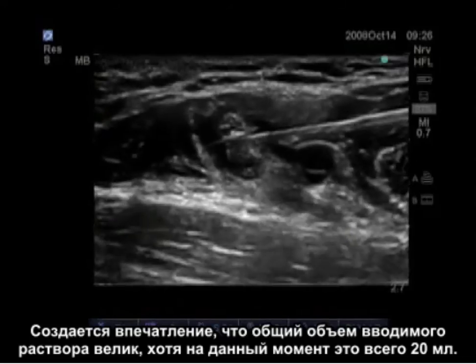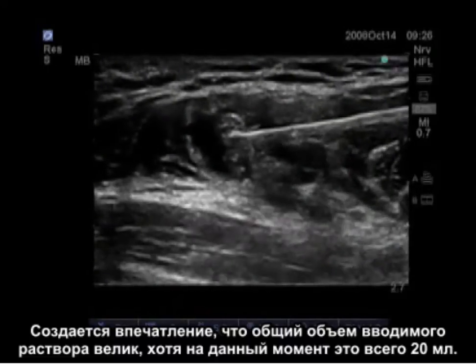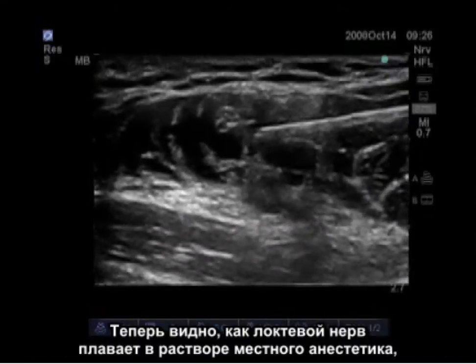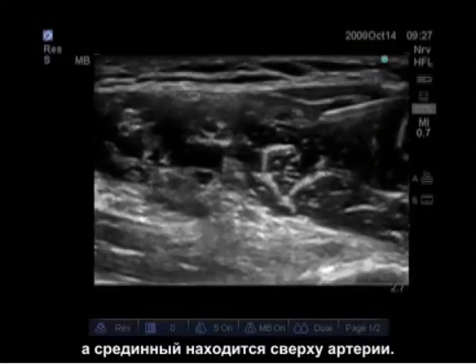Total volume injected appears large but it is only 20 milliliters so far. The ulnar nerve is now visible floating in the local anesthetic, and the median nerve is visible on top of the artery.